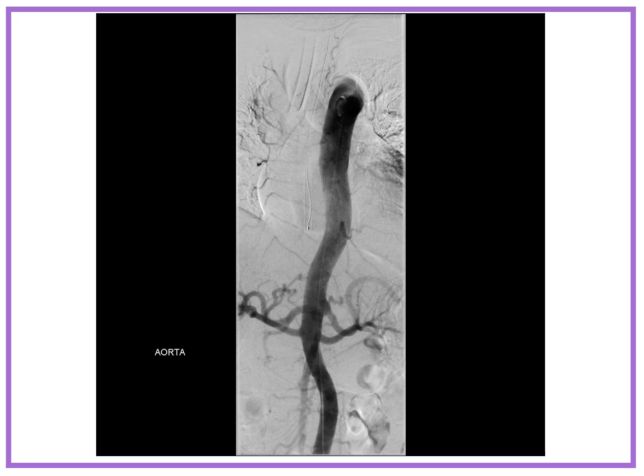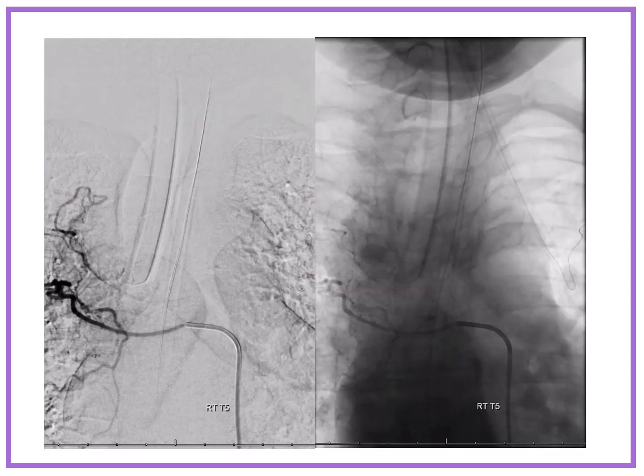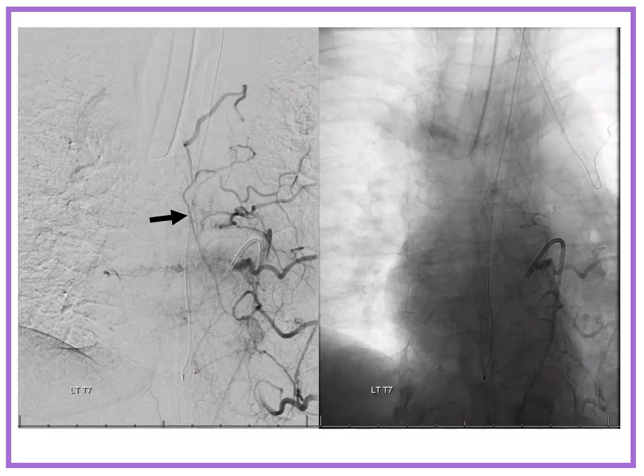So here we go. This is an aortogram. That's usually how we start, especially when the spine is not exactly very straight, just to give us a guide. Now we proceed. We do our usual thing. Here we start just mapping them out. Right T5, and so we go.